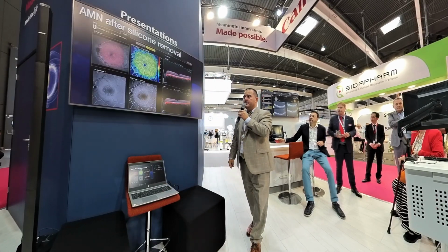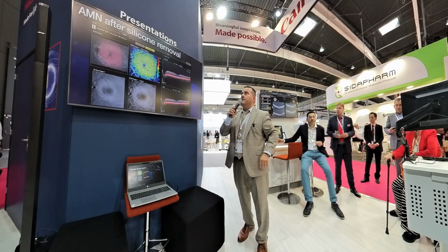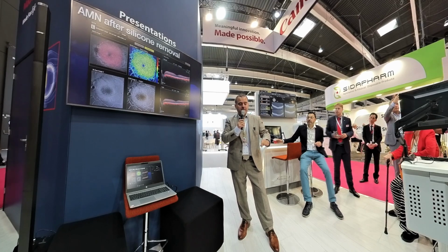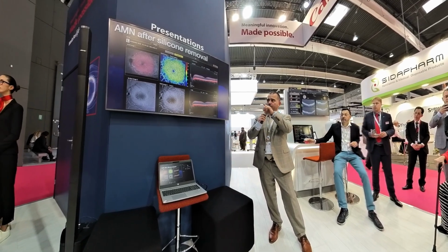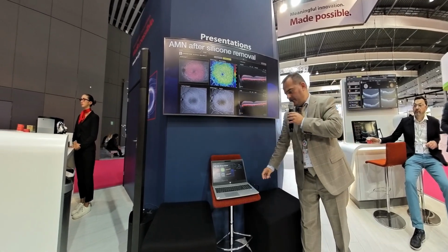So, another similar condition, acute macular neuroretinopathy after silicone removal. Again, something which we might experience as vitreoretinal surgeons, and it's really devastating. Again, we can pinpoint the area of the incident, and this can explain the scotoma that the patient sees.